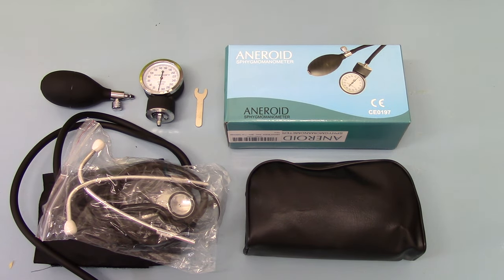Welcome to this product demonstration video where we're going to show you what comes out of the box when you purchase a Valumed Aneroid Sphygmomanometer and Dual Head Stethoscope.